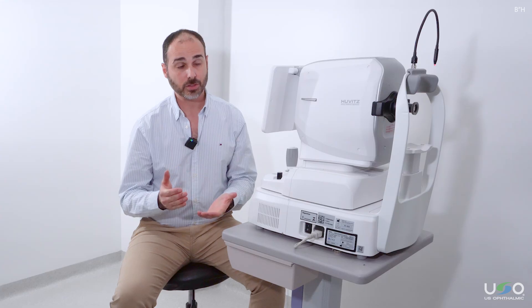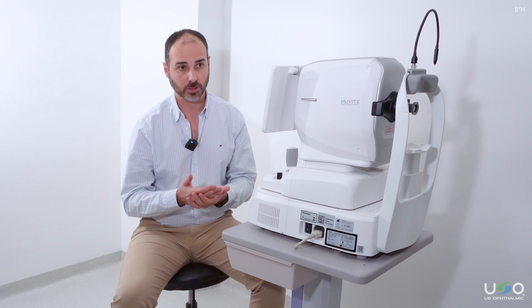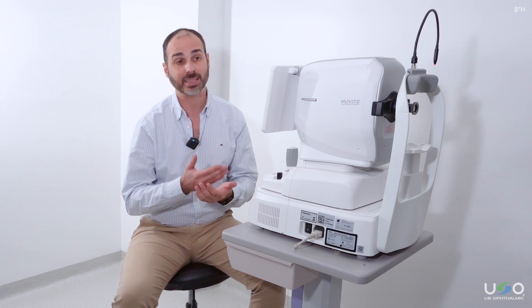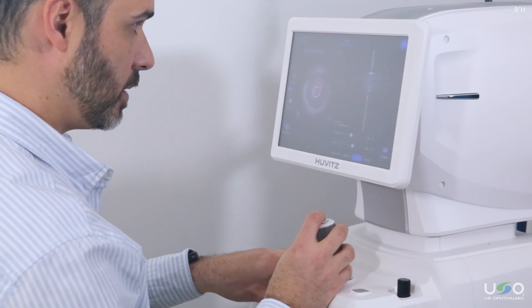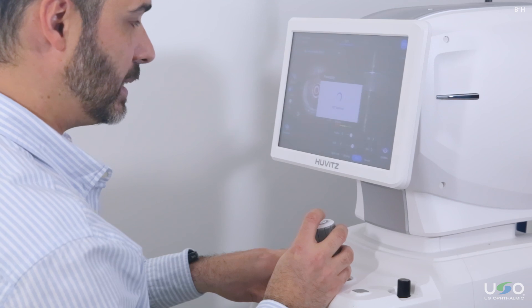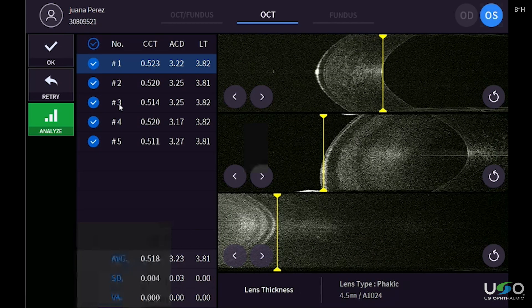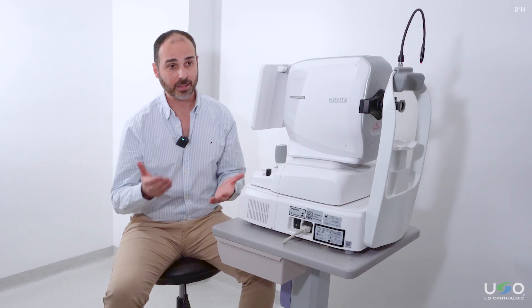The greatest benefit of the OCT Biometry module is that we have a visual confirmation of the elements of the eye. In other words, we will see the cornea, the crystalline lens, anterior and posterior segments, and the macula with a level of detail that will allow us to select the exact measurement points so that we can be sure that our measurements are correct.